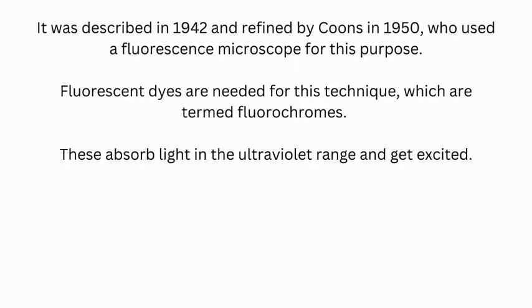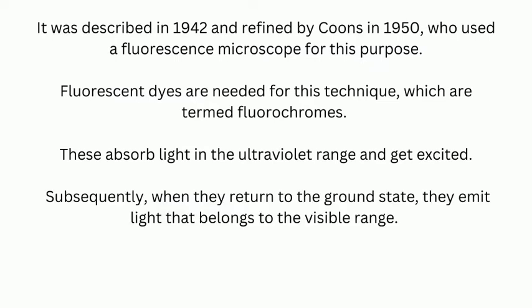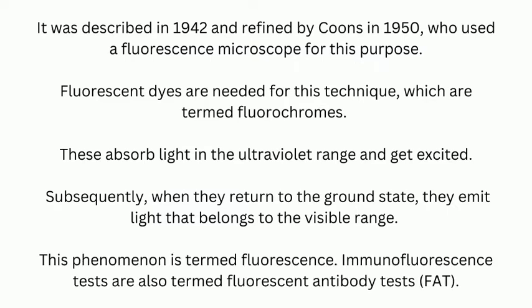These absorb light in the ultraviolet range and get excited. Subsequently, when they return to their ground state, they emit light that belongs to the visible range. This phenomenon is termed fluorescence. Immunofluorescence tests are also termed fluorescent antibody test, or abbreviated as FAT.